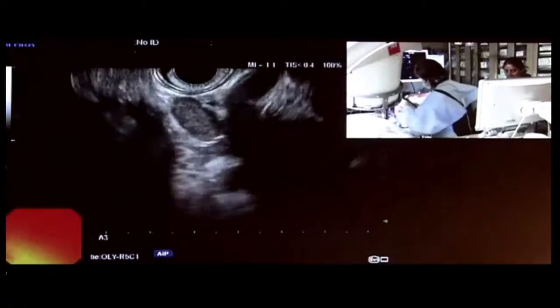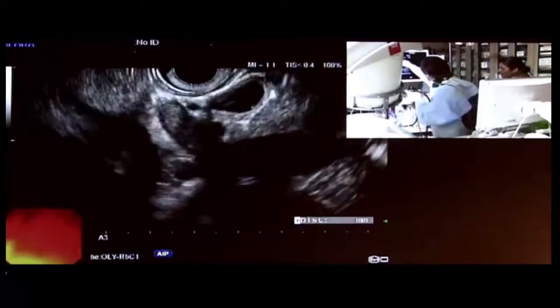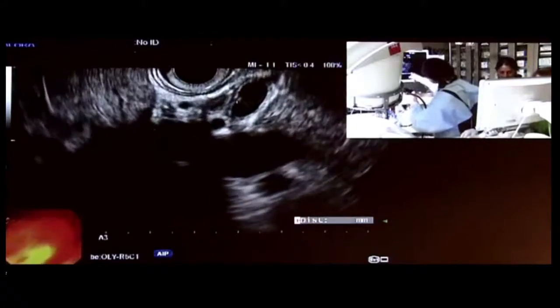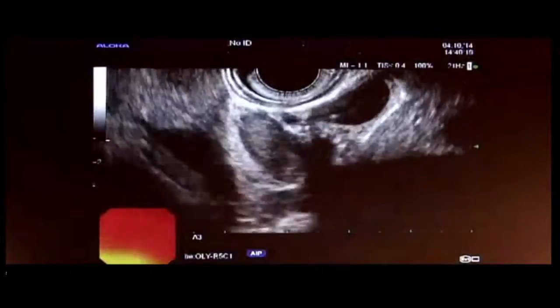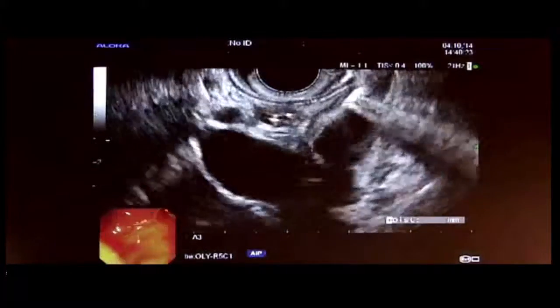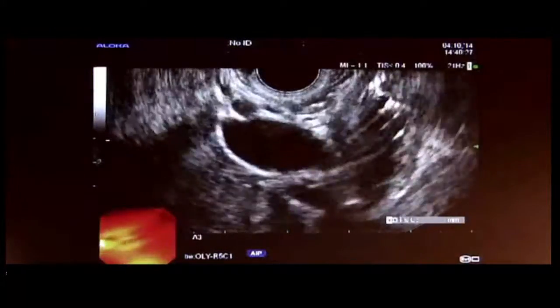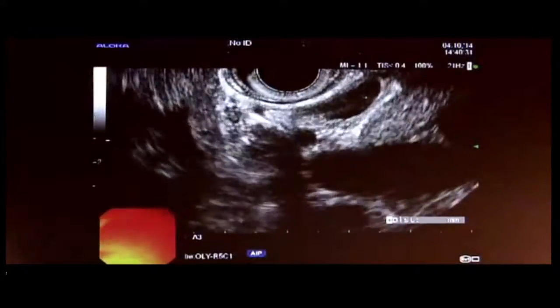But we'll just take a quick look here. I think this is the bile duct that's right up here. You can see the cystic duct come off of it. You can zoom in, please. So that's right there where the cursor is, the bile duct. And you can see the cystic duct join the bile duct right there. And then you can follow it; there's some air in the bile duct, which we expect, of course. There was a metal stent in there. And there's the bile duct. We can follow it. There's lots of artifact from the air, and now we're coming back down towards the papilla.